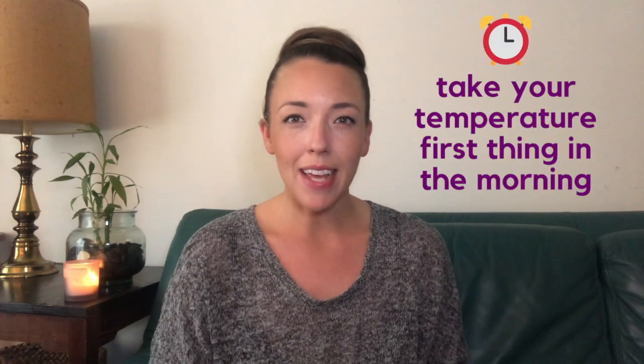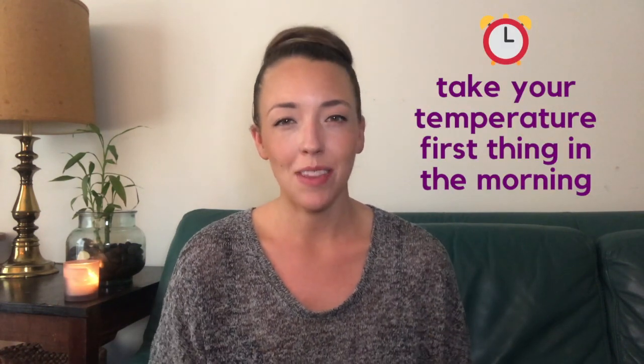Number 1, the most important thing to know about taking your basal body temperature is that you need to take it first thing in the morning when you get up, before doing anything else. Taking your temperature has to be the first thing. So before you get up and go to the bathroom, before you grab your phone and start scrolling through Instagram, it has to be the first thing.